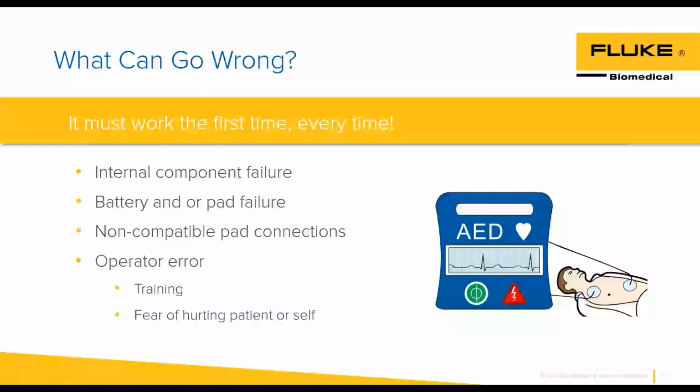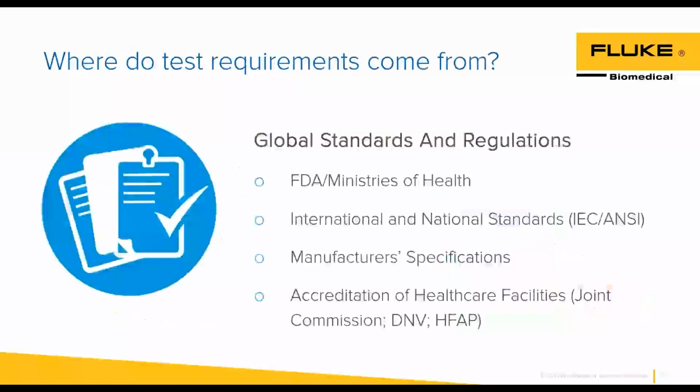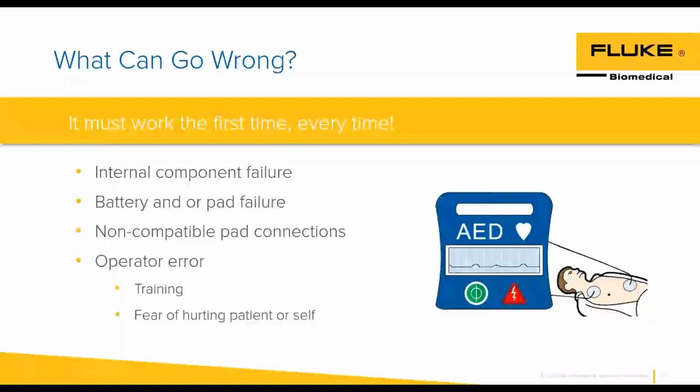And then let's get down here to this operator error, and we'll go back up to the top. So operator error, I just had to redo my CPR class the other day. And when I redid my CPR, we're talking about AEDs and training. So a lot of the AEDs would say we're going to shock the patient. Well, people get freaked out because the patient's already in a bad situation. Now it's saying to shock them, and they don't want to do any additional harm. So some people might remember some AEDs now say treat the patient versus shock the patient. So is our general public trained? Because sometimes these failures that we're seeing might not be an actual internal component failure, but a setup or training failure.